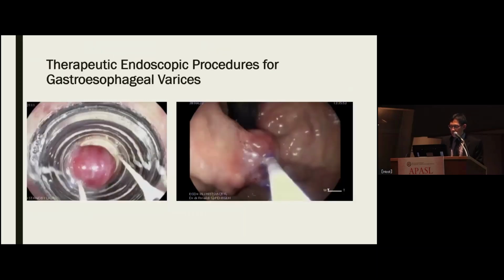This is the standard endoscopic procedure that we perform every day in our clinical practice.